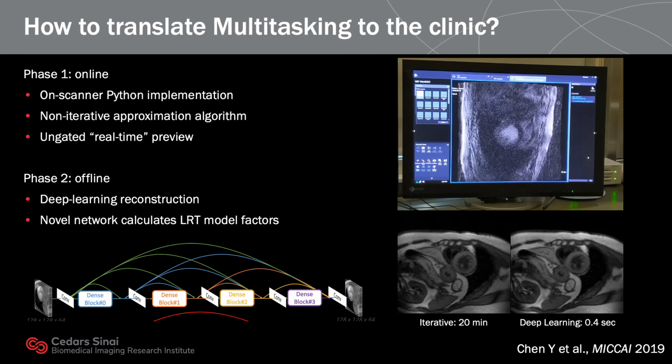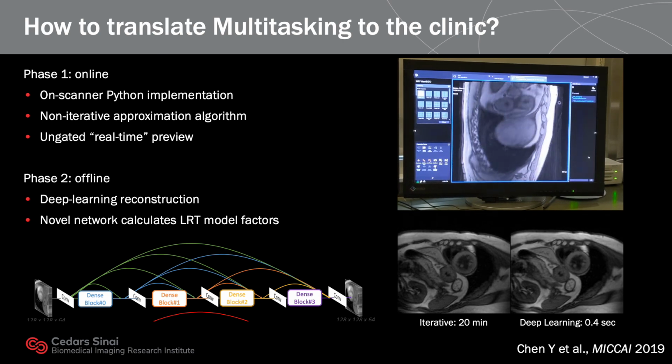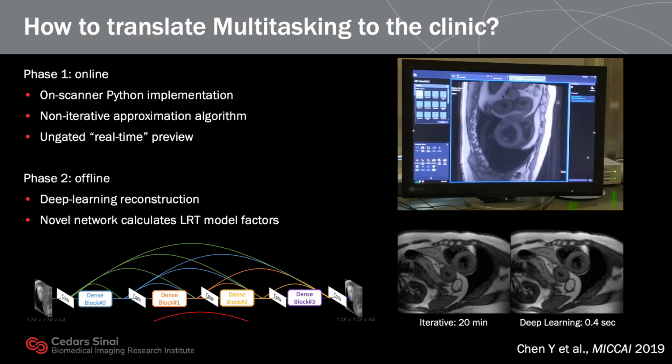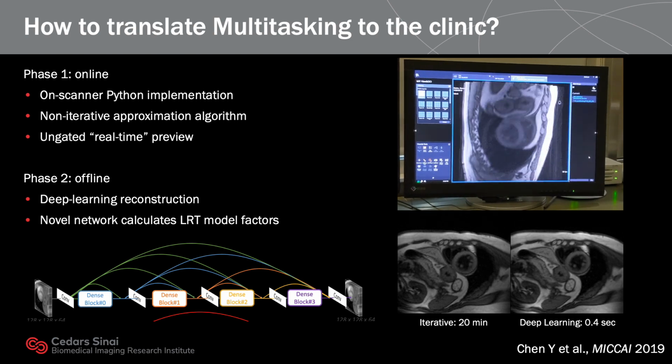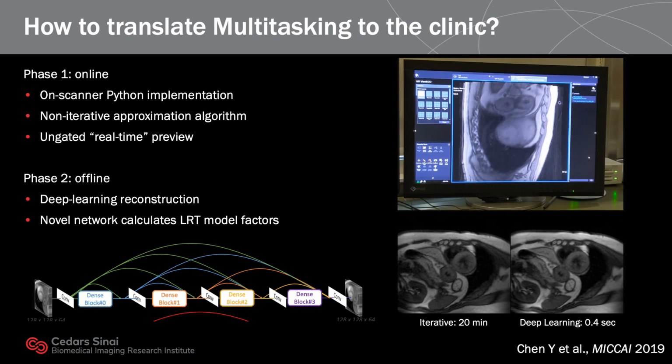Bill Chen of our group has developed a deep learning approach to dramatically reduce the recon time from 20 minutes to sub-second. We have also worked with Siemens to allow real-time preview of the images to make sure the scan is okay before offline reconstruction.